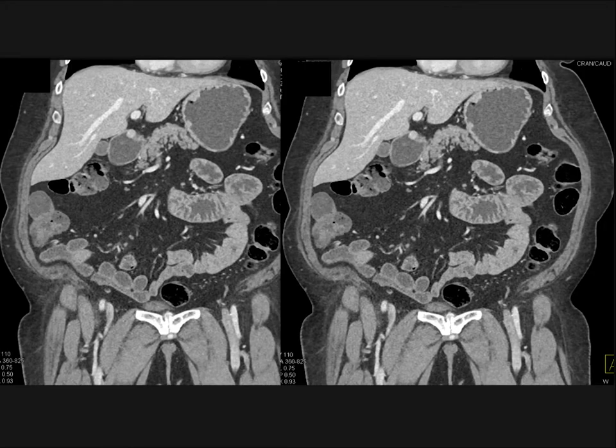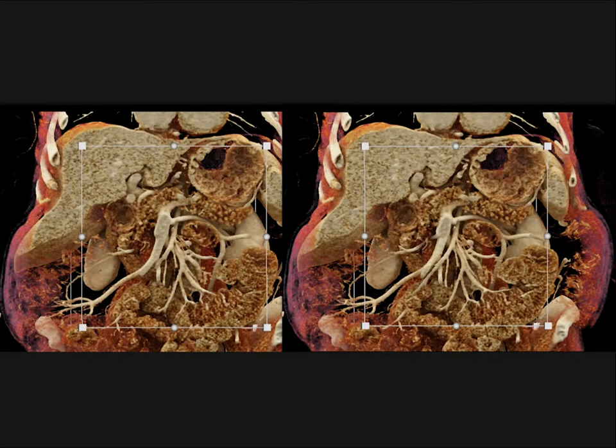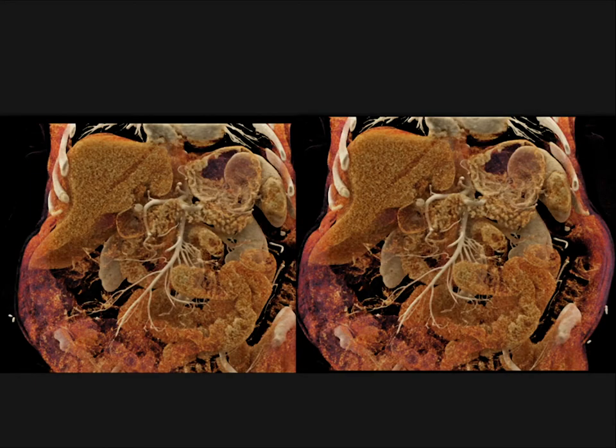You also see how important oral contrast is. You can see the stomach is distended, and so the duodenum is distended. And because the duodenum is distended, you see the lesion. Now, I did this also with cinematic. We're trying to use cinematic to show us this better. And you can see right here, the lesion is shown very nicely in that 3D coronal plane. Just a very good visualization of that lesion.